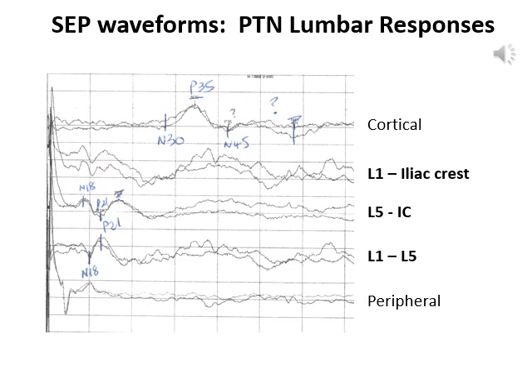The other two montages, both the L1 to iliac crest and the L5 to iliac crest, should phase reverse with the L1 to L5 tracing. We see this in the middle tracing with the L5 to iliac crest montage, but the tracing is not so clear in the first one, the L1 to iliac crest recording.